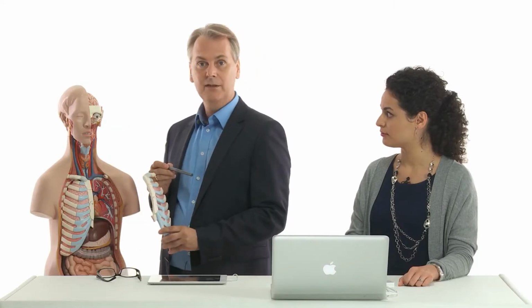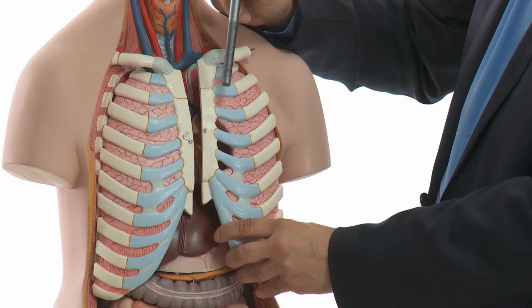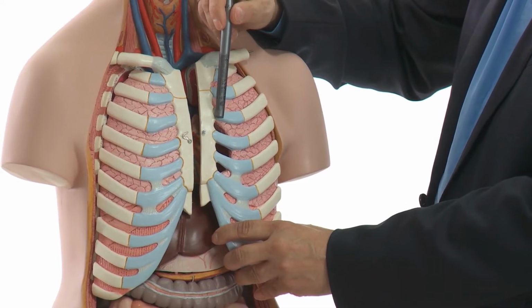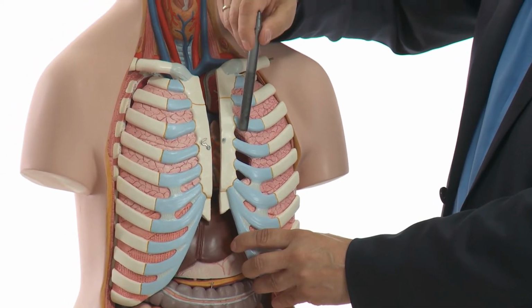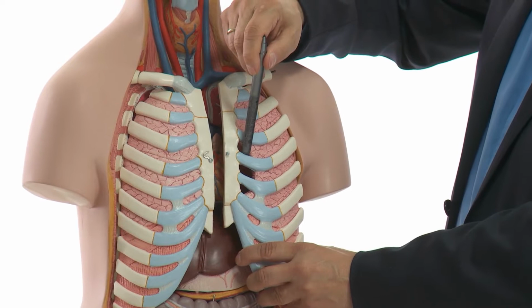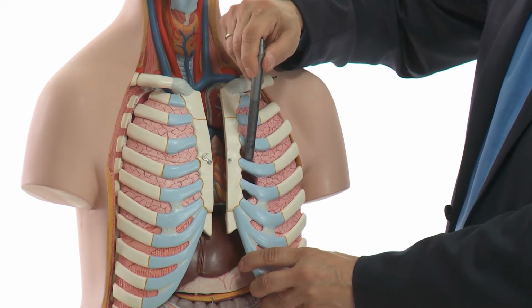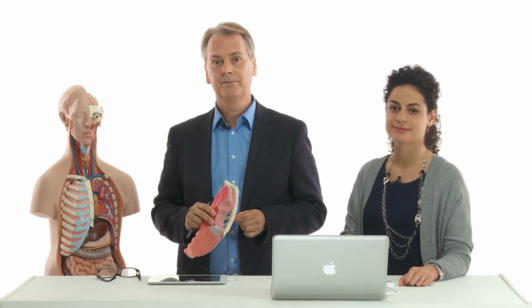And then finally, we always learn that we should image in the intercostal space. My advice to you is that you sometimes use the rib to your advantage, and you can place the transducer right here on the corner of the rib, and thereby you can get an angle into the intercostal space which allows you to peek behind, for example here, the rib which is further below. So these are some of the tricks that I think can help you in your daily practice and to help improve your image quality.